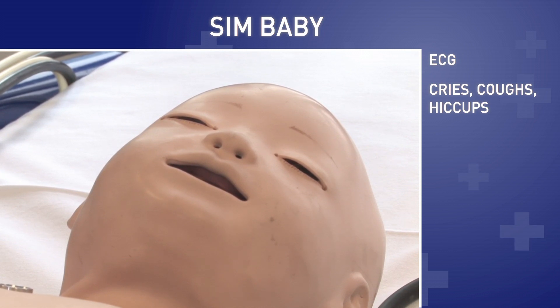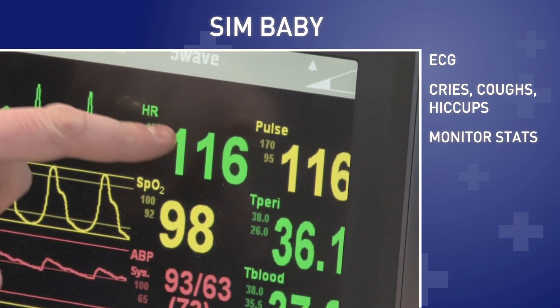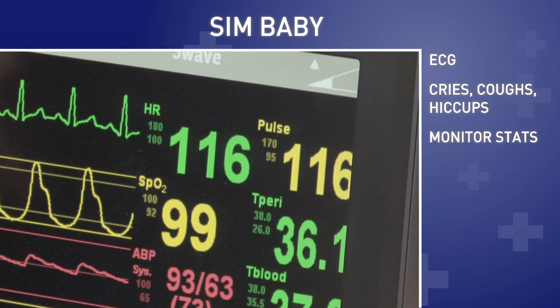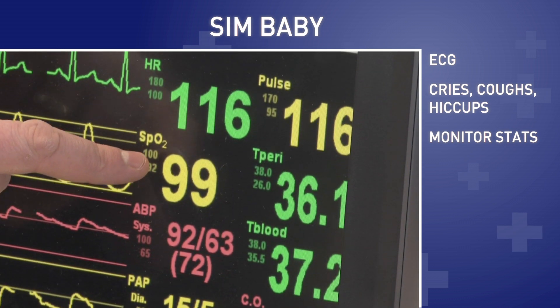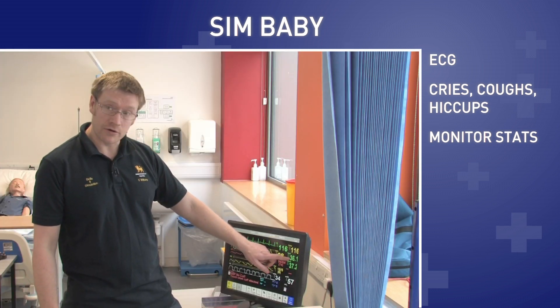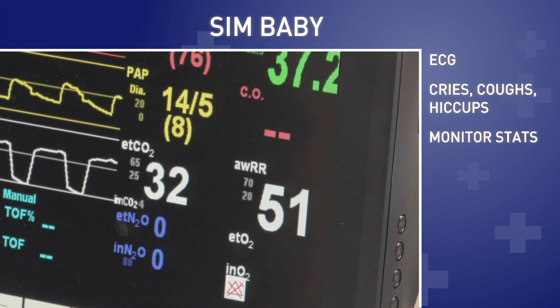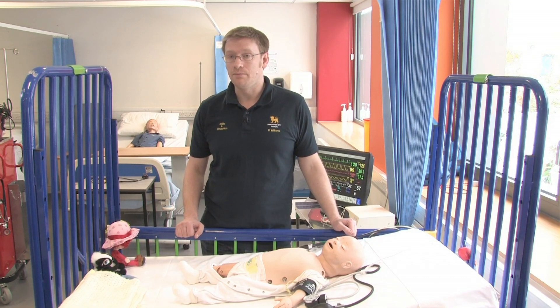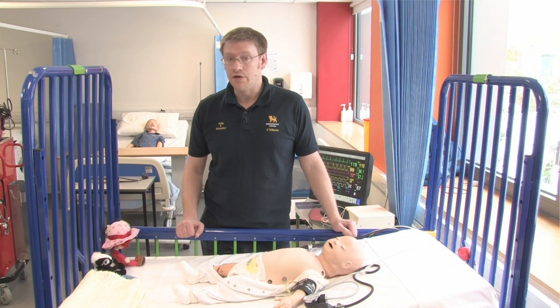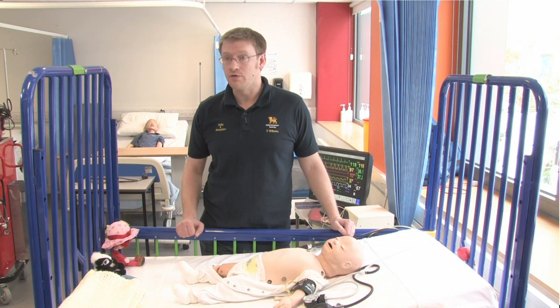Simbaby also has a monitor here which we can use to simulate his heart rate, his ECG rhythms, his oxygen saturation levels, his blood pressure, his temperature, and down here is his respiratory rate. The Simbaby is used throughout our nursing courses really extensively and is a really good learning resource for our students.